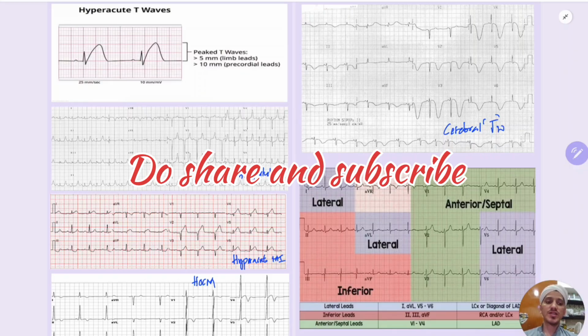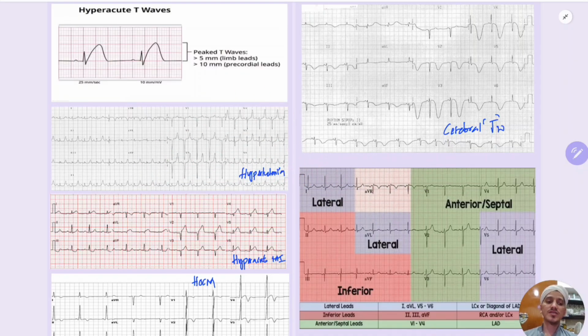The previous two ECG videos were based upon the theoretical criteria of STEMI and NSTEMI, unstable angina, what are pathological Q waves, and a detailed explanation of different kinds of T waves schematically and also in ECGs. From now onwards, we will discuss different types of myocardial infarctions. So let's begin with the name of Almighty.